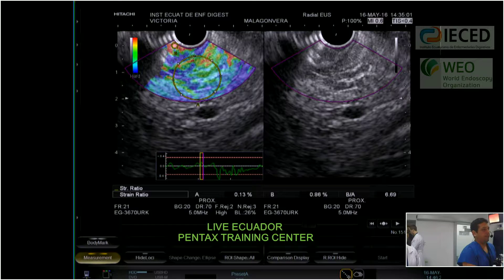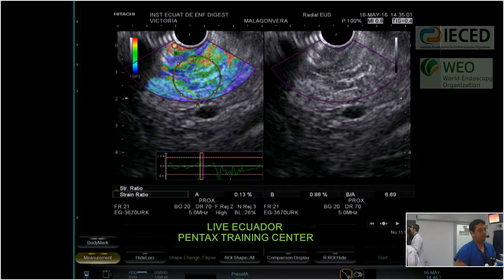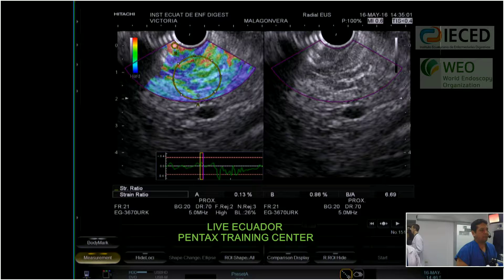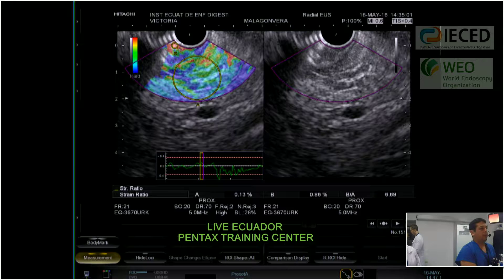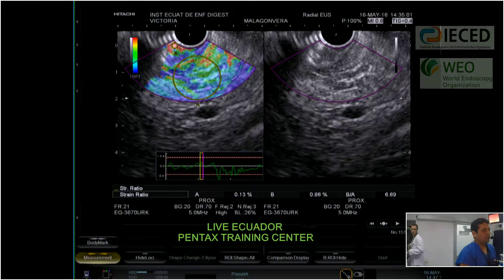In addition, we are performing quantification of this elastography using the method proposed by Julio Iglesias and his team, using the strain ratio — a comparative analysis between the region of interest, which is the head of the pancreas, and the soft tissue reference, in this case the mucosa layer. This comparative analysis showed a difference of 6.69.